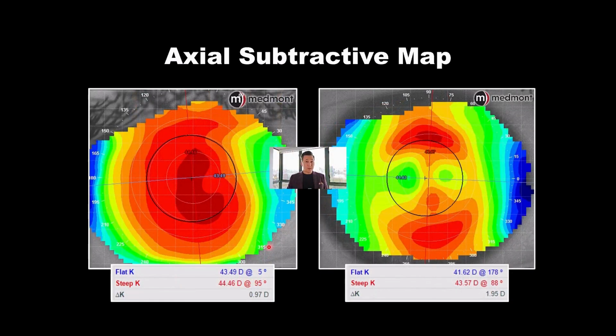So when we look at the K readings, at baseline we're about 1 diopter of corneal astigmatism. Post-treatment, we've doubled the corneal cylinder. So it makes sense that the patient was manifesting so much astigmatism. 175, I think, was what was noted. So how do we address this?